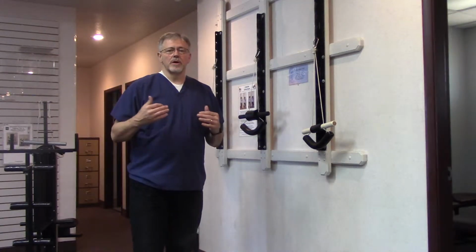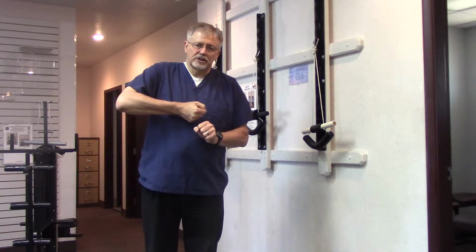Cervical traction. It actually gets more than just the neck, but this is one more way to warm up your tissue. We talked about the wobble chair, we talked about the warm-up exercises, we talked a little bit about the figure eight. We're going to do another video that talks about the figure eight, but particularly what we want to do is change the white tissue, causing what we call hysteresis. Hysteresis is where we stretch the white tissue down its long axis.